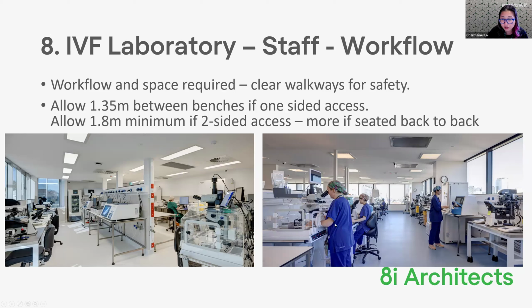Whereas the lab on the right that I have, it's got about 2.2 meters. And that's simply because we have people working on both sides, and also the thoroughfare within the lab is between the benches. So with the amount of movements, because this is a fairly large lab that generally has a lot of people, with the amount of movements, we've made that walkway wider just to reduce accidents.